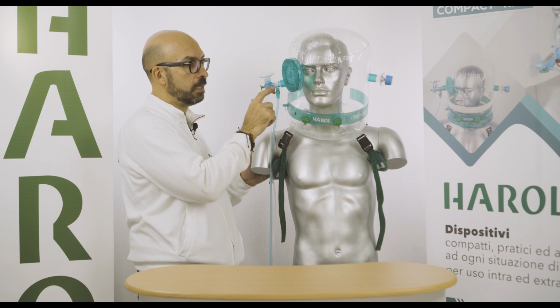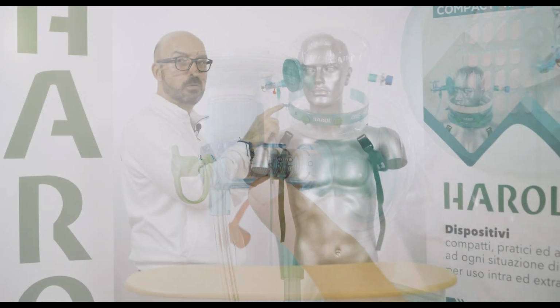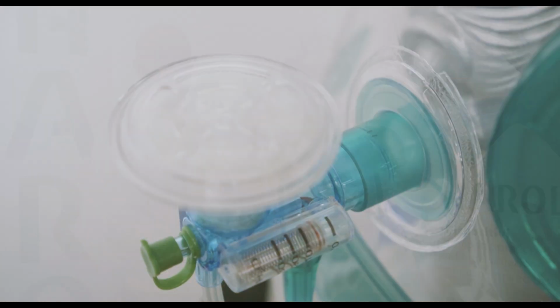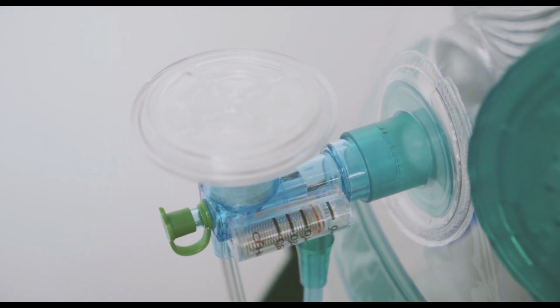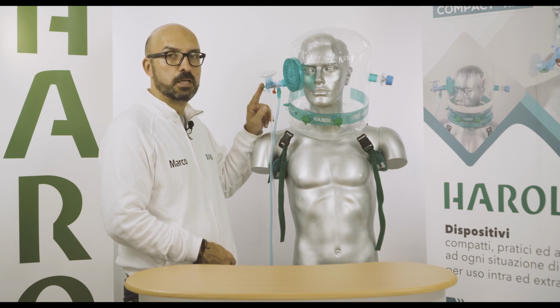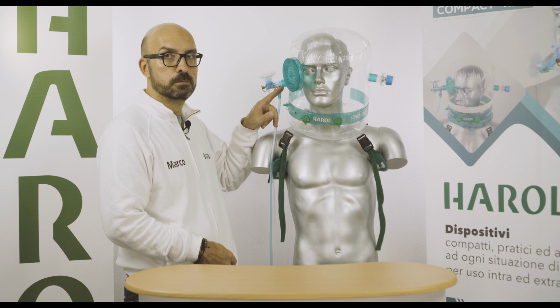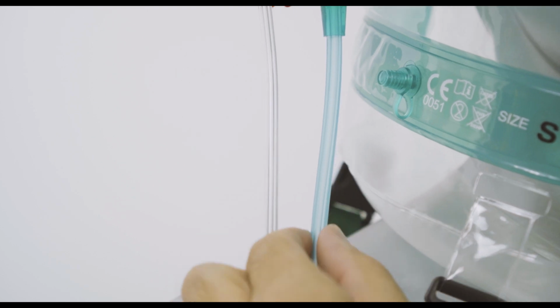A compact Venturi device is connected to the helmet in the entry line. This Venturi device can deliver a flow of 50-60 liters per minute, and therefore allows a good CPAP therapy and above all guarantees the disposal of CO2. For safety reasons, the pressure gauge is glued and cannot be removed. The Venturi needs 2 oxygen lines, one to regulate the air-oxygen flow and the other to regulate the FiO2. For correct operation, 2 flow meters must guarantee a nominal pressure of 3.5 bar.